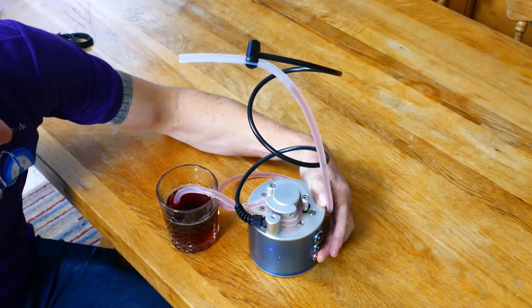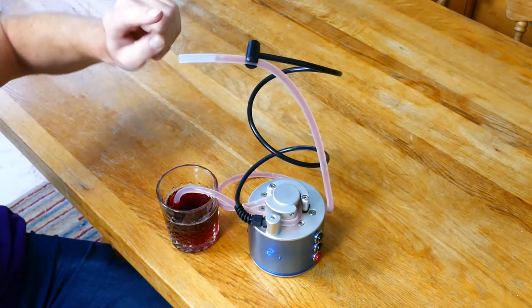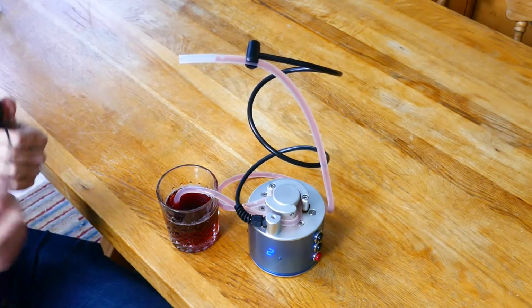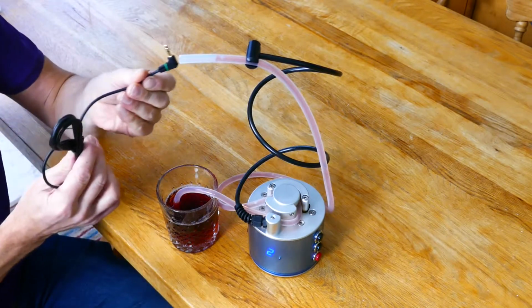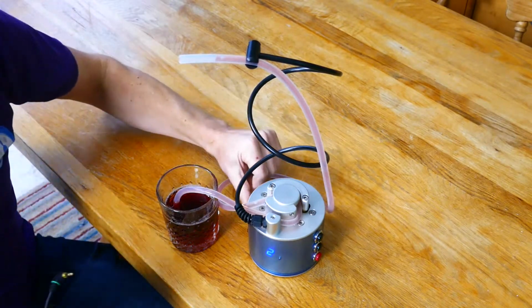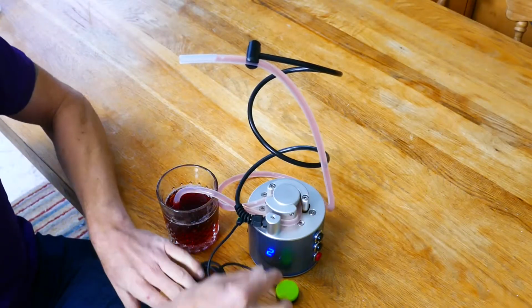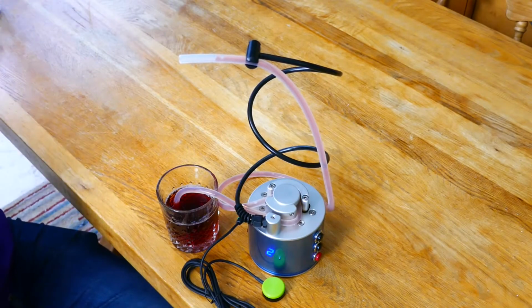As the drink gets close to the top of the straw, I'm going to stop. So we've got the drink all the way up here now. So to actually use the drinker, we next need to plug the switch in. So there's a socket here where I'm going to plug it in. I'll put the switch there.